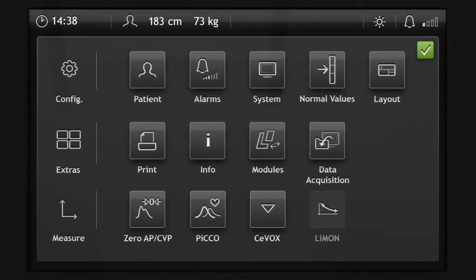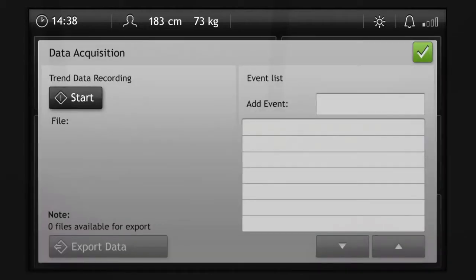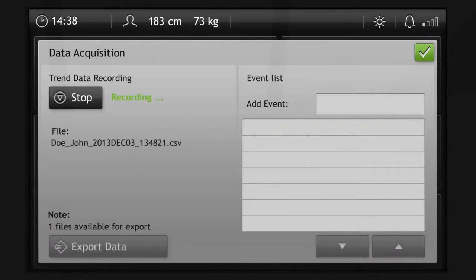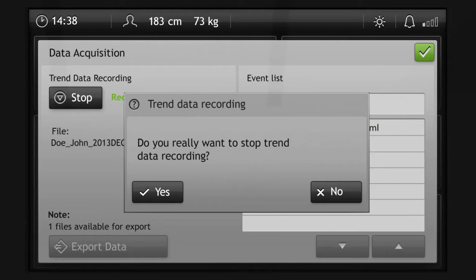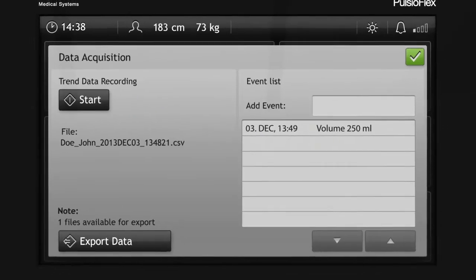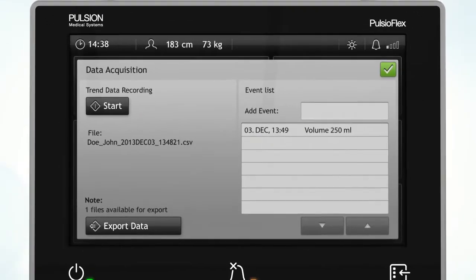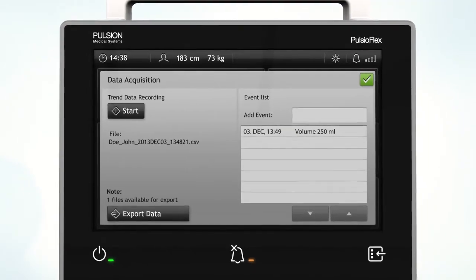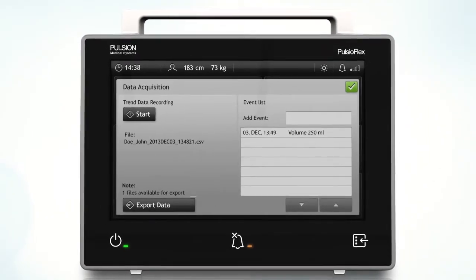PulsioFlex offers the ability to record all parameter data, mainly for study or therapy analysis purposes. By tapping Start, data acquisition can be initiated. User-specific events can be defined and tracked in the event log. By tapping Stop, data logging will finish. Having a USB stick connected to the PulsioFlex, a comma-separated text file can be exported by tapping Export Data.